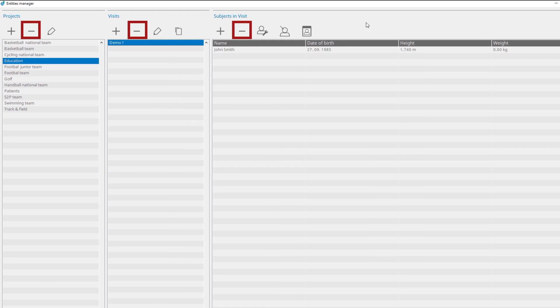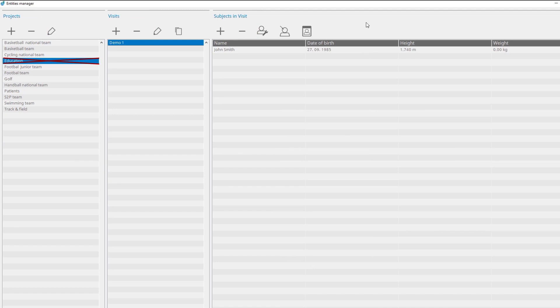You have to be very careful when deleting a project, visit, or subject. When a project is deleted, all visits and measurements assigned to the project will be permanently deleted from the database.